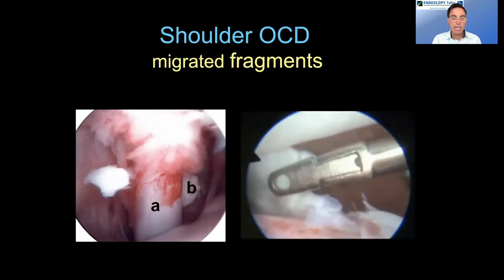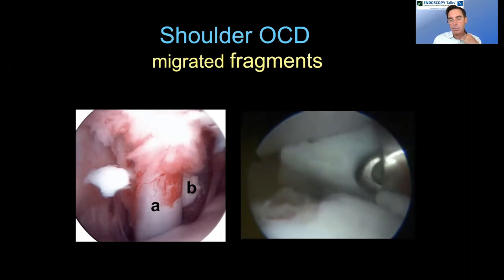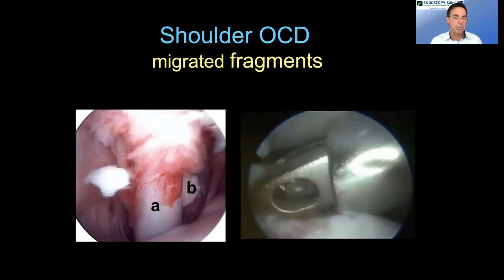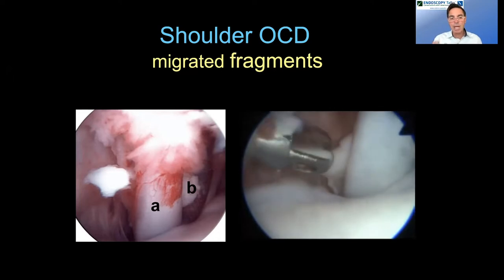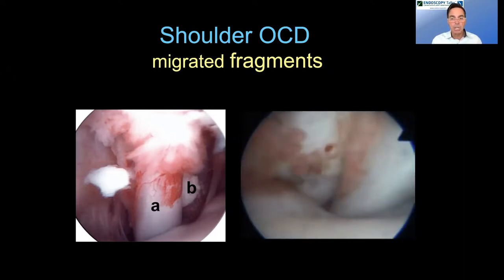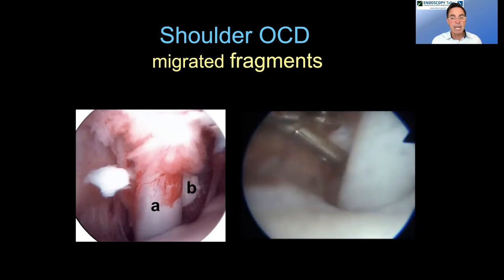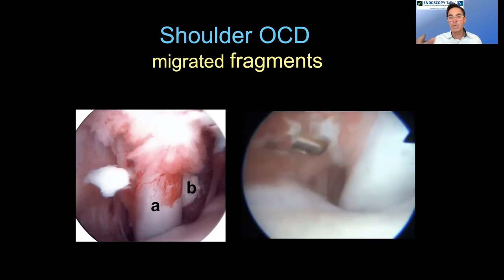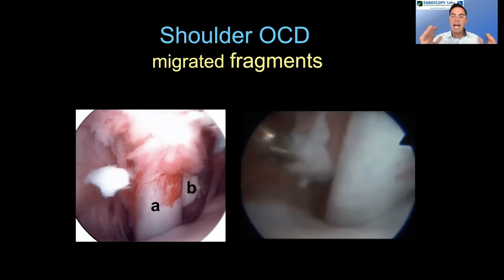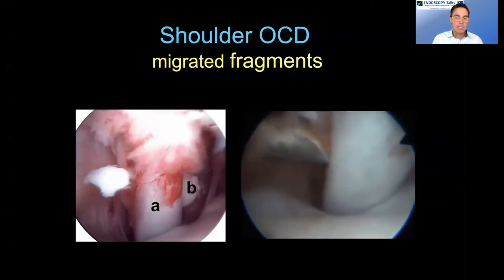You can certainly go in open and remove this fragment like here on your right in this video. The problem is oftentimes there are pieces that have broken off and gone to the front of the joint that you cannot see. The image on your left shows an example of 2 fragments floating around the biceps tendon. These fragments can float down the biceps tendon sheath and actually grow and attach to the synovium. So we can go in and look at the biceps tendon, as shown on the video now, and you can see these big fragments that floated up front. If we had not done arthroscopy, we would not have known that those were up there, and they would have been left in the shoulder, and this could have led to residual lameness. So arthroscopy lets you look at the entire joint, not just a little area right back by the humeral head. You can see much better in the joint with arthroscopy than you can with arthrotomy.